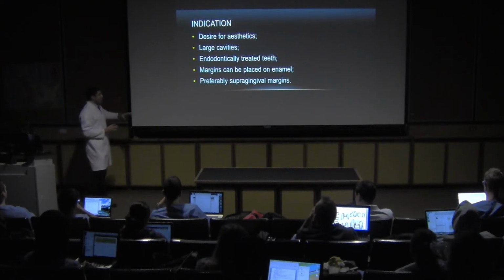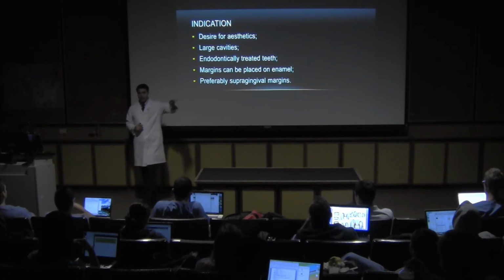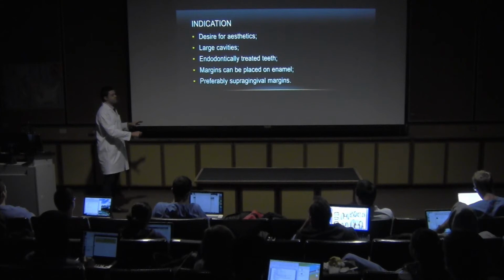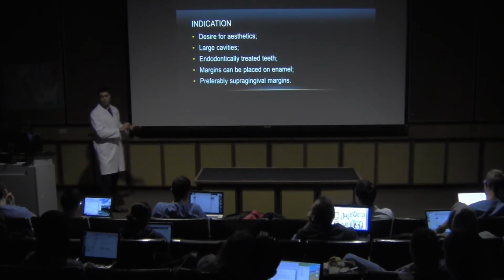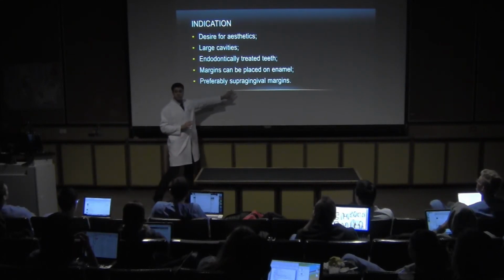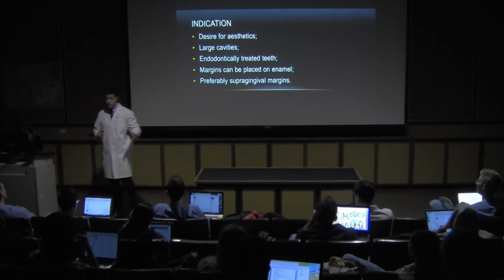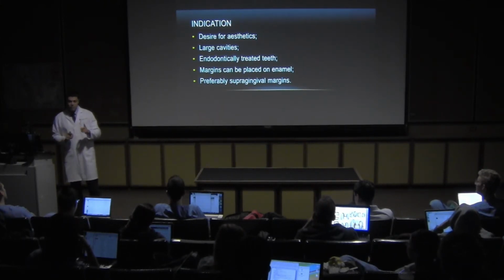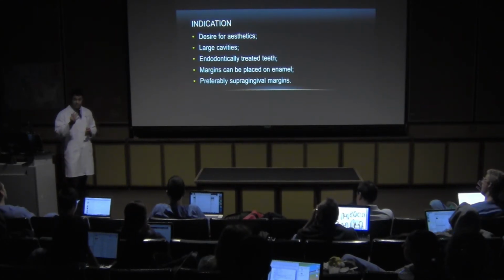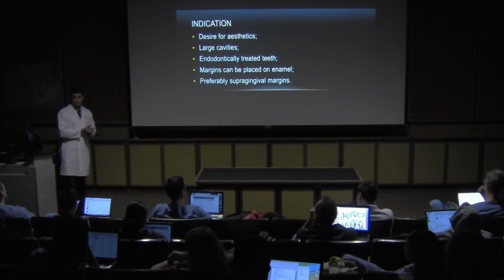And for now, let's think about that we prefer to have supragingival margins, okay? And in a new topic, you will learn how to work with gingival level or subgingival margins. But now, let's just think about having supragingival margins. Okay, it's preferable for this type of restoration, mainly because of the technique. We are going to a cementing process, the same way composite resin is, sensitive.